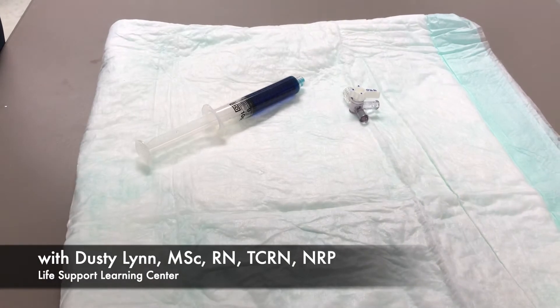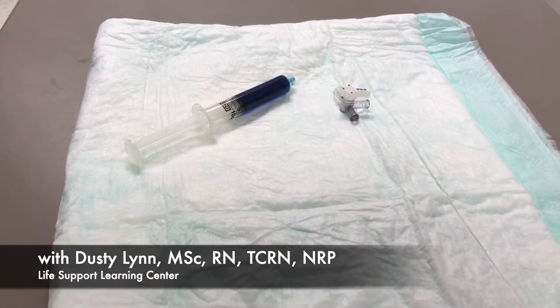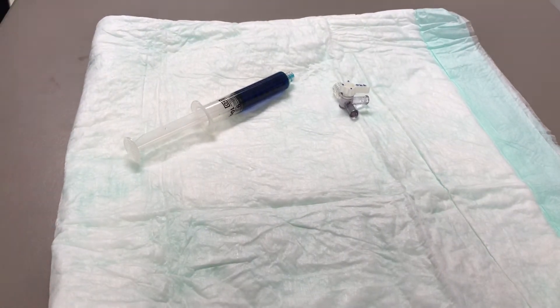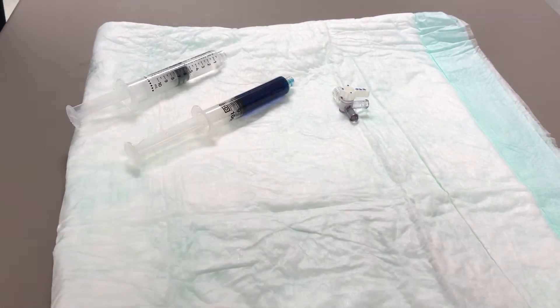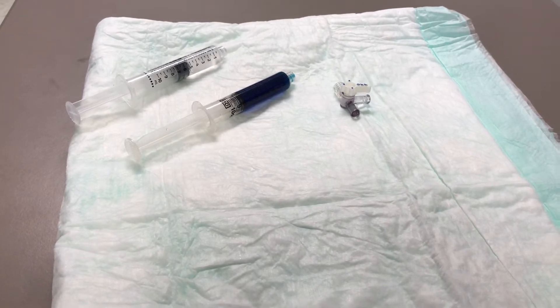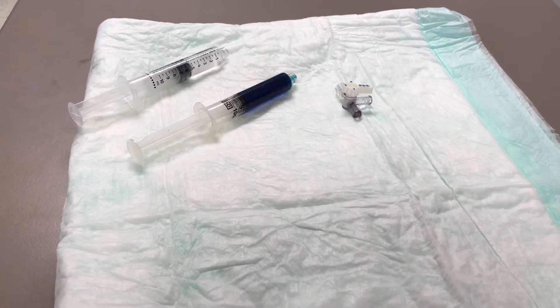Hi and welcome back to Dusty's Corner. Today we're going to go over the simple method of priming a stopcock and also how to use it with all sides open. I say this because even one of the famous training videos that we watch nationally has a three-way stopcock only open two ways when giving adenosine and then having to switch it back.